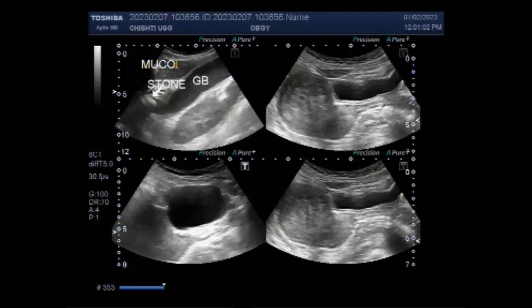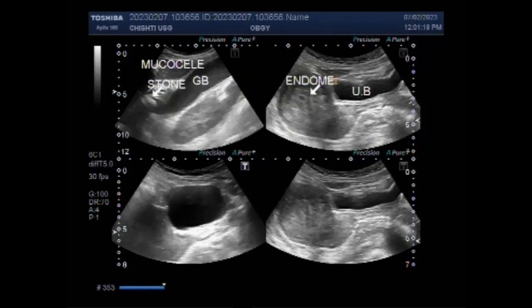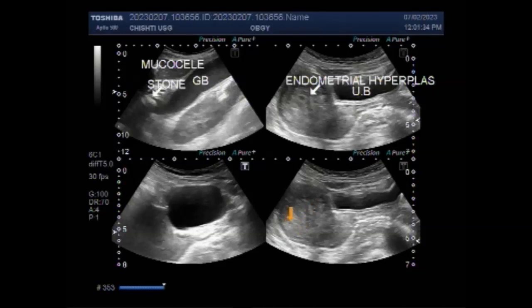Now you can see the other findings seen in this patient. This is the endometrial hyperplasia — the increased thickness of the endometrial lining, which is the endometrial layer visible here.